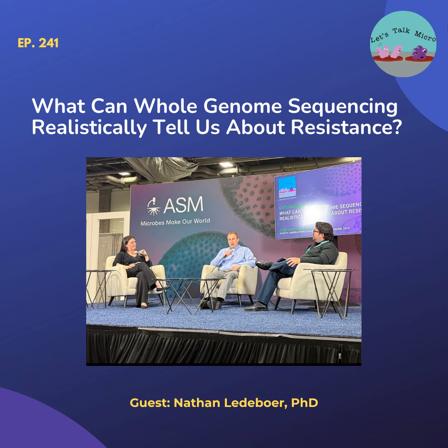When you call them with that result, they've got a minute to talk to you. So it's going to be critical that you understand how to convey that in a way that A, they understand it, and B, that they act upon it. And we've had a lot of really good lessons over the last 15 years or so in involving pharmacy and involving our antimicrobial stewardship colleagues to really help us, because not only can they now convey information on the test result, they can convey it on the treatment result too.